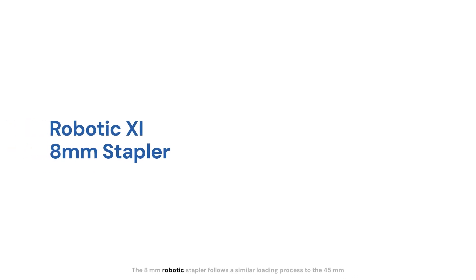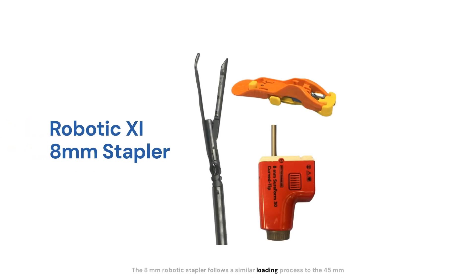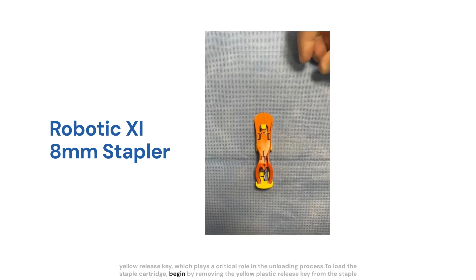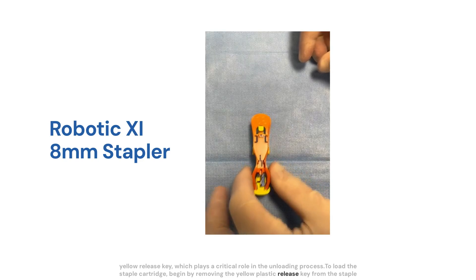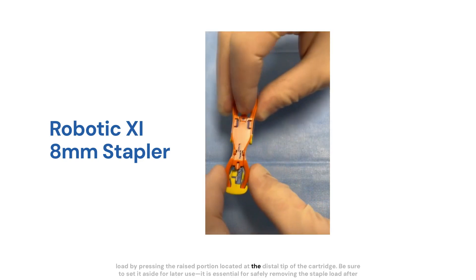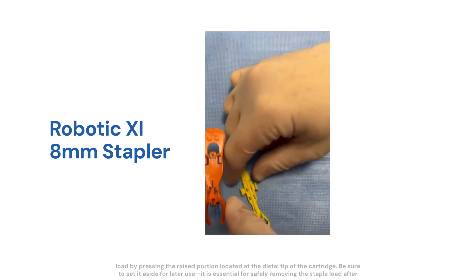The 8mm robotic stapler follows a similar loading process to the 45mm and 60mm staplers but includes an additional component: the yellow plastic release key. Each staple reload is packaged with an orange retainer and an attached yellow release key, which plays a critical role in the unloading process. To load the staple cartridge, begin by removing the yellow plastic release key from the staple load by pressing the raised portion located at the distal tip of the cartridge. Be sure to set it aside for later use.